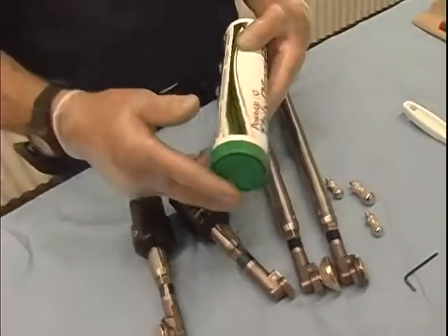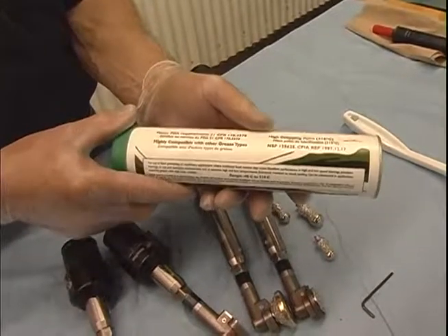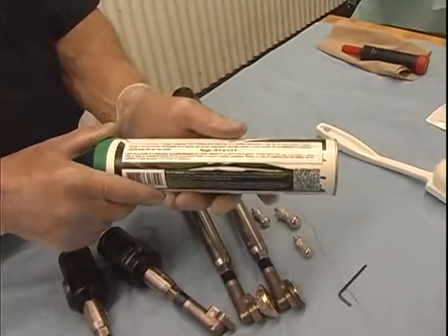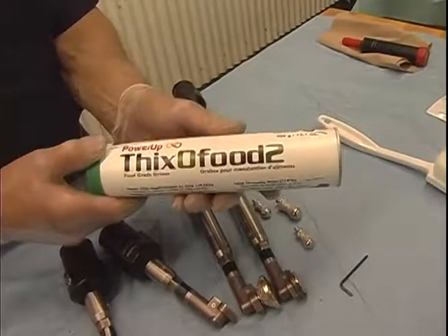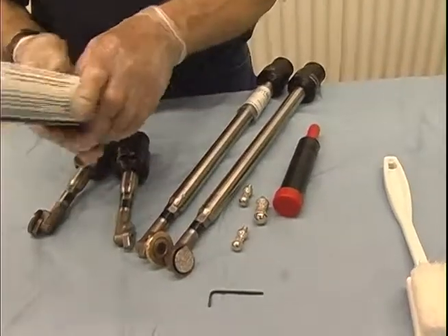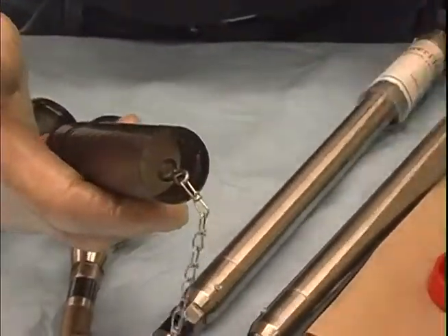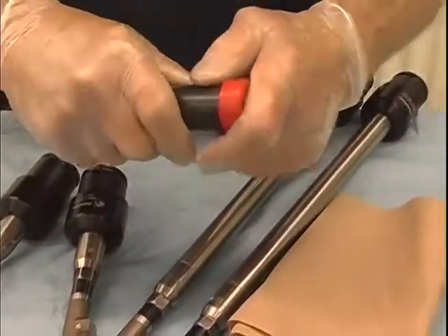The type of grease that is used is a food grade grease. One of these tubes is supplied with each gun, and if you're going to get a supply in Europe, you should be looking for a grease that is food grade, made for gears, and has anti-rust properties. That is the desirable type of grease to use. This is put into a regular grease gun, and from this tube the grease is pumped into this. There's a plunger here. You pull the plunger out, fill this up with grease with the grease gun, put the plunger back in, push down, and it's ready to use as a grease gun.